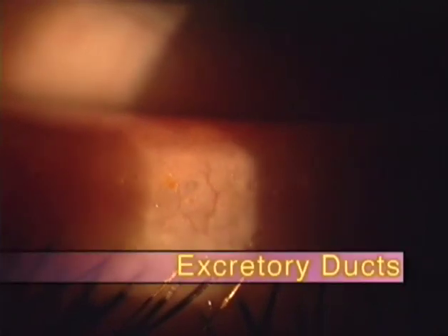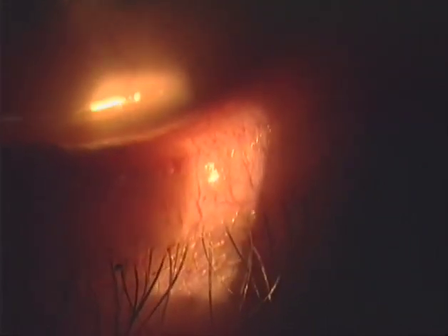The excretory ducts of the glands may remain visible in direct light beneath the epithelial cover despite the occlusion. In this particular case, however, the ducts do not appear in direct light, but the hidden ducts can be made out in indirect illumination, and then are seen as bright spots in the dark field beside the illuminated area.